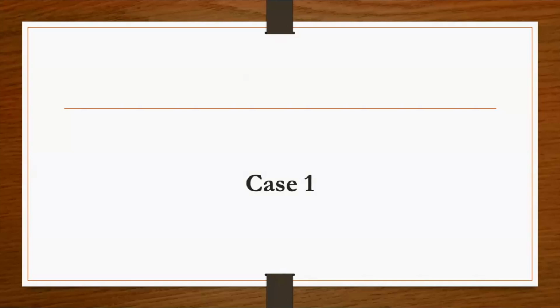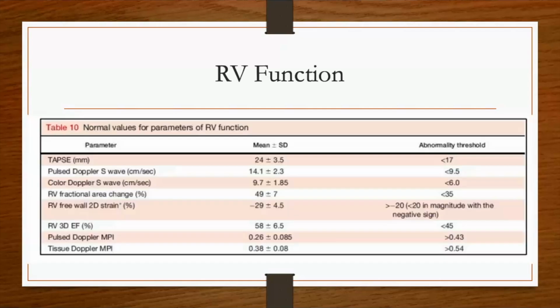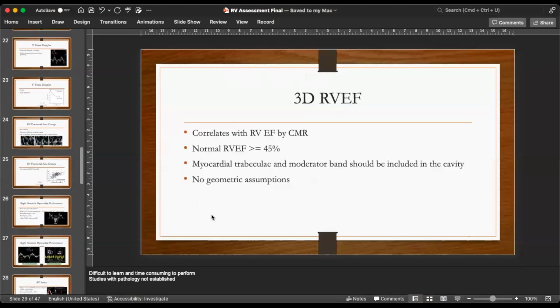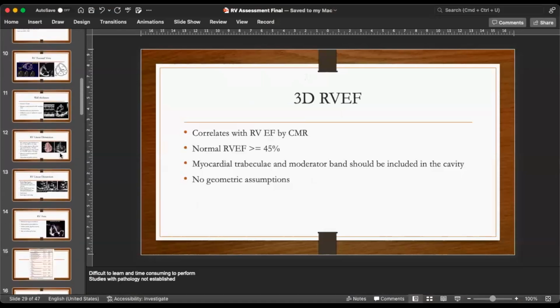When you say focus view, what does it mean? For us, focus view could be like you zoom on it, right? How do we do the focus view? That's a good question, to assess the true size and then the function of the RV. Let me go back. Hopefully, I won't lose that.